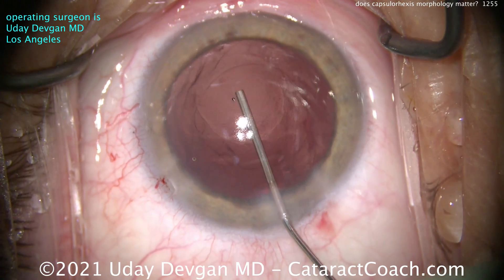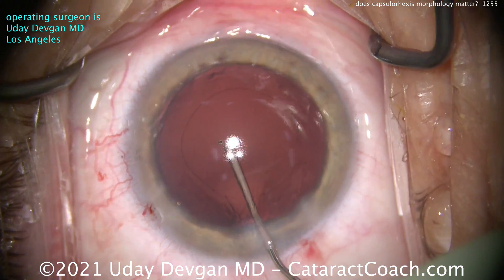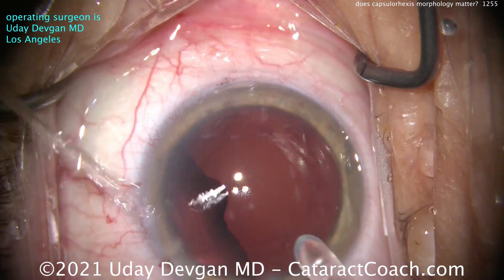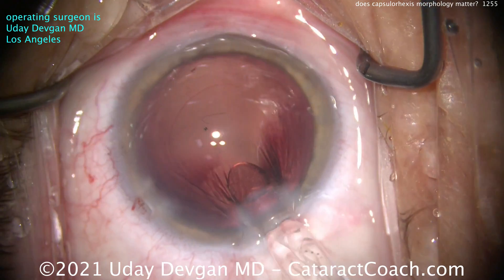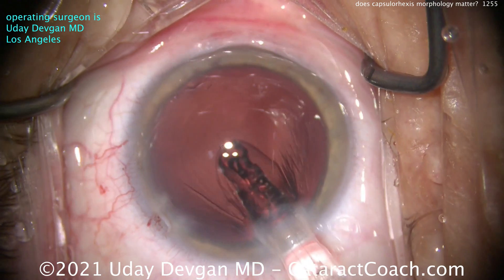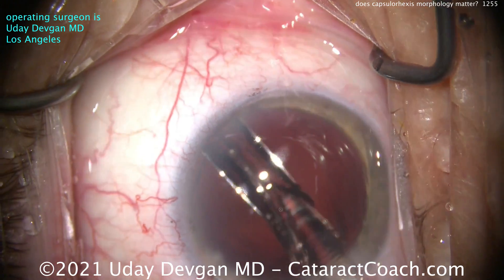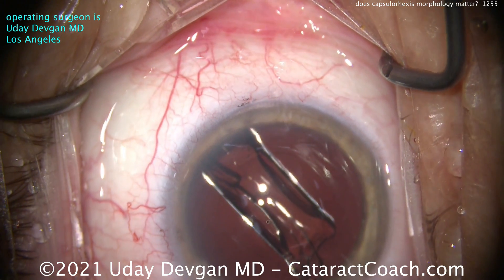Here at the end of the case, filling the capsule bag — you can see it's a pretty good rhexis. It's just that one area that is less than perfectly circular. Now, if you're a beginning surgeon, a novice, or a resident, you may think this is of no consequence. But as you do thousands of these cases, you really want to perfect your game. I want to show you that obviously there's no such thing in our field as 100% perfection.